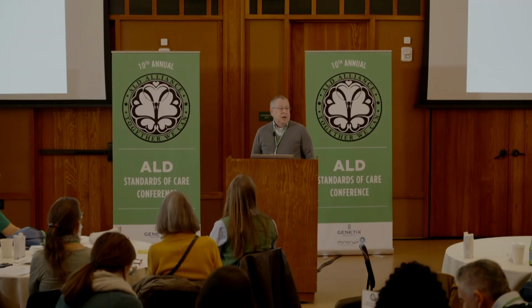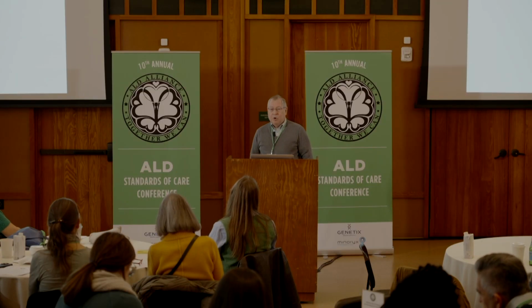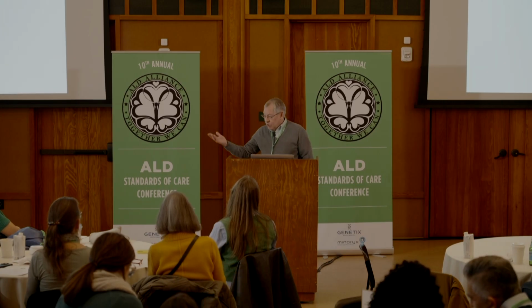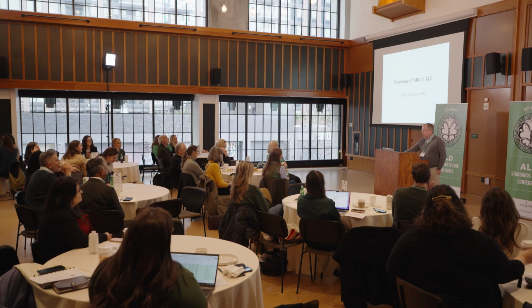If I teach you anything today, it's called the Loes score. Dan pronounces his name Les. I know it looks like Loes, but it's pronounced Les, and we're going to respect that.